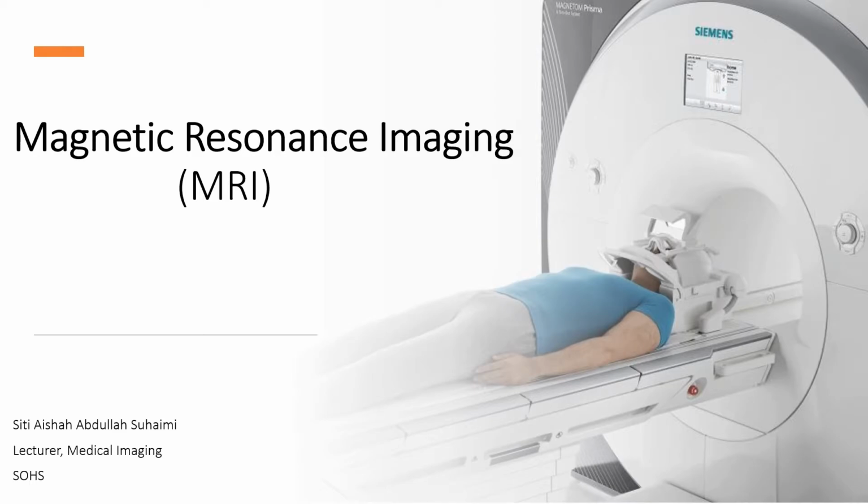So MRI, the name itself, contains magnetic, resonance. It works with this kind of resonance, or we call it echo, which will interact with and realign the hydrogen atoms inside the human body, and it is to be imaged. So we call it one of the specialized equipment for imaging, which gives more detail. That's why it is called magnetic resonance imaging or MRI.